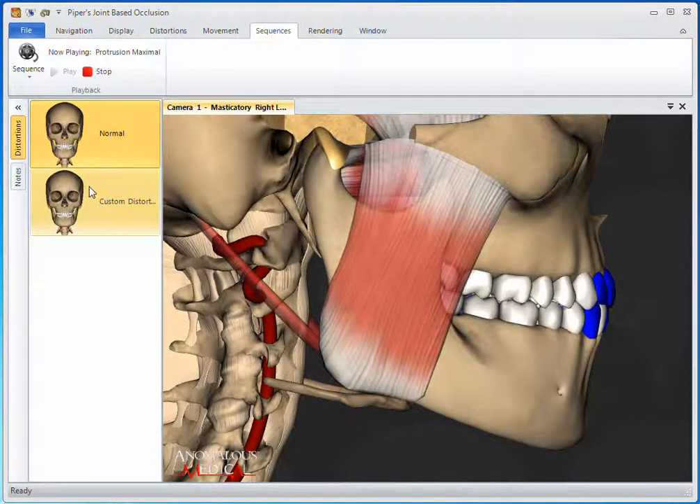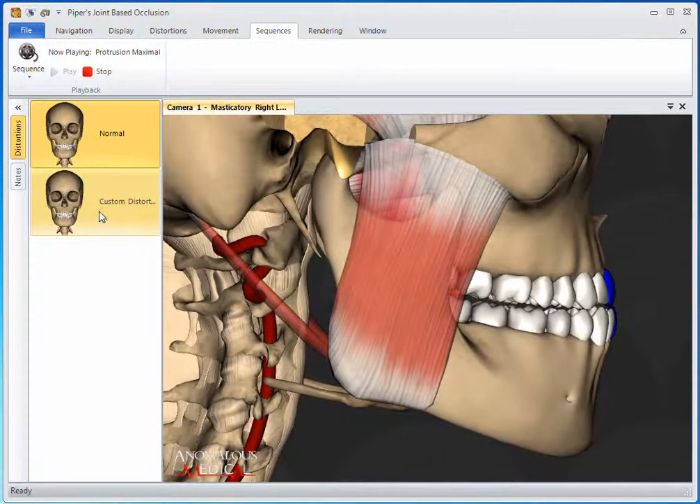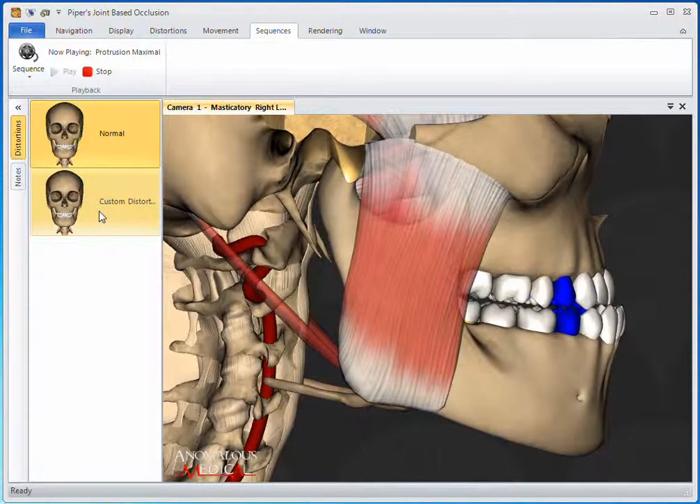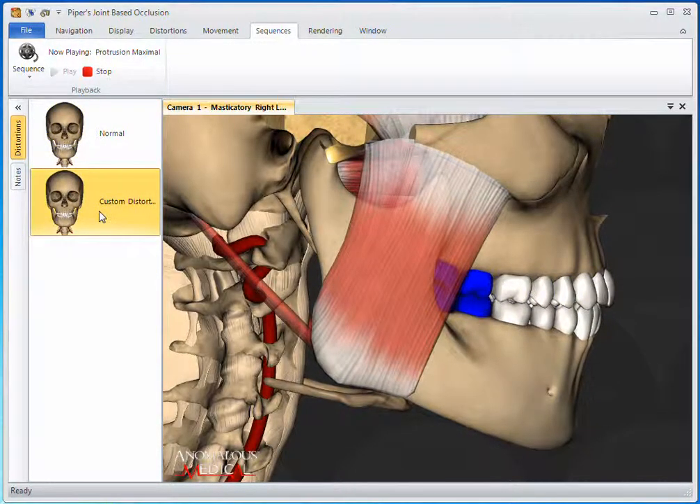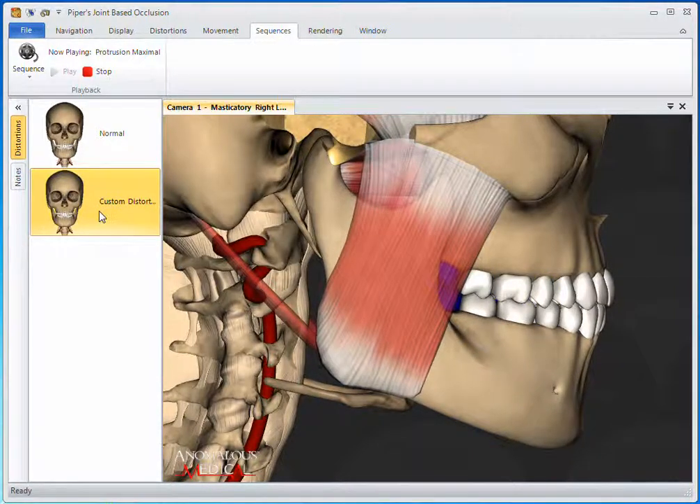If we apply a distortion, such as this one where the discs on both sides have been moved to 9 o'clock, we can see that the back teeth are now the main source of guiding during this sequence instead of the front.